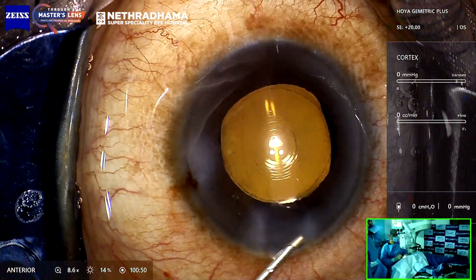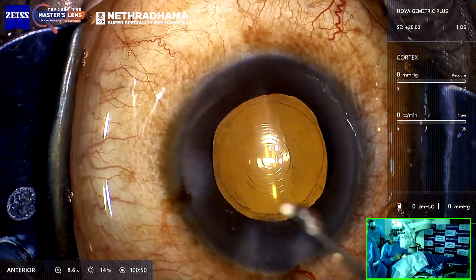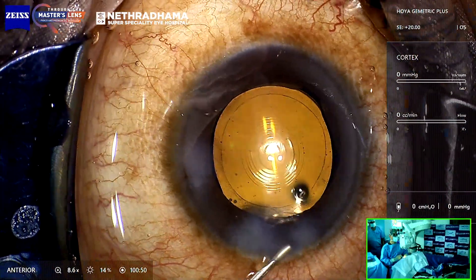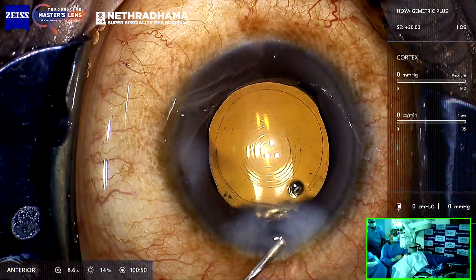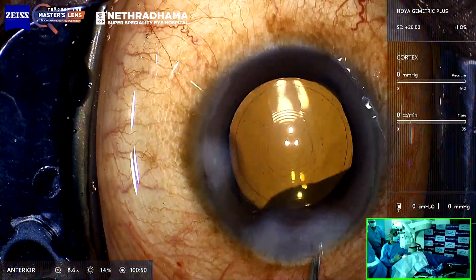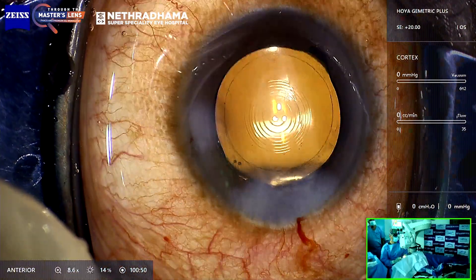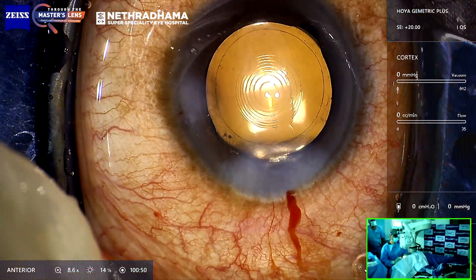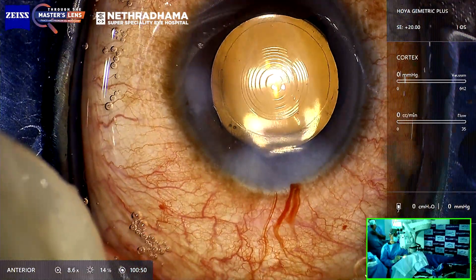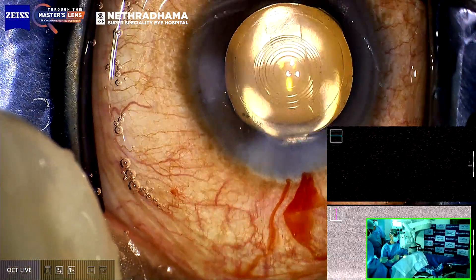Even if the wound were slightly leaky, just using BSS alone without infusion means I don't even have to hydrate the wound — you can see it's well formed. The wound is quite tight. You can see the lens is beautifully centered with a 360-degree overlap. I hydrate the sides; you can also hydrate the bed, which closes the wound very tightly. You can see the Purkinje images are exactly in the center of the optic — it's a 3.2 mm diffractive zone and it's beautifully centered.